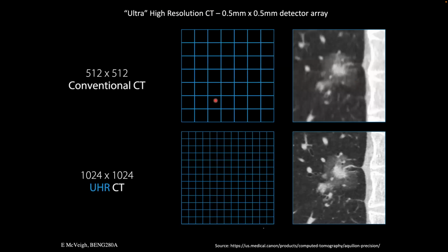So looking at changing the resolution of the detector element, this is for GL theta, this is the L direction, right? So we've taken a standard conventional CT detector, and these are normally separated by 1 millimeter distances at the centers. And this vendor, this was a really gutsy move. They said, you know what, we'll just cut these. We'll make 4 detector elements for each one of these. And so this is what their detector element looks like.